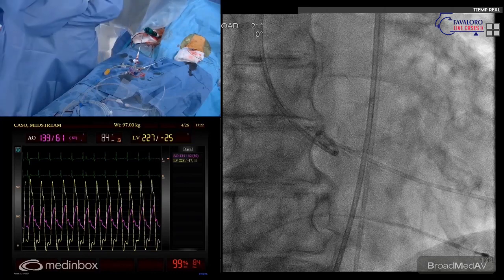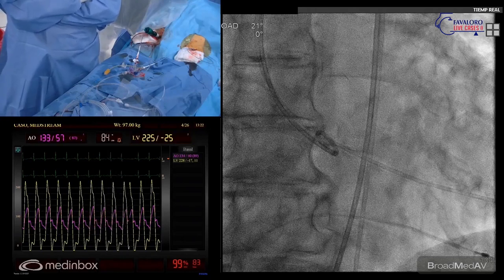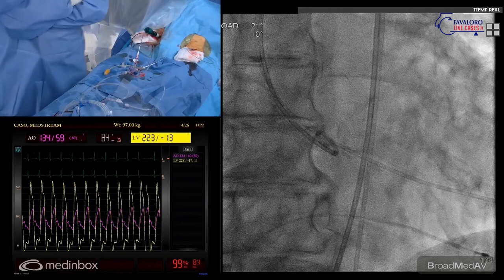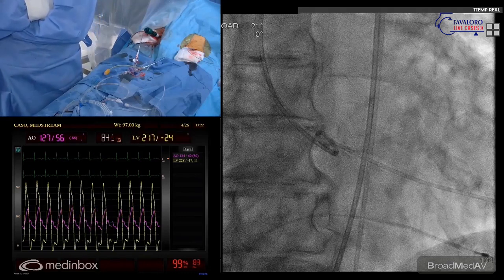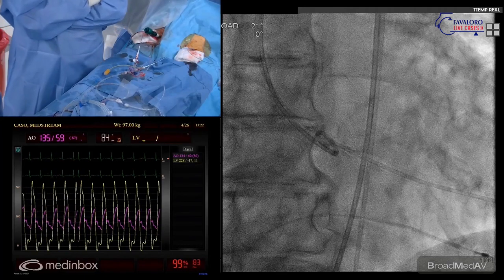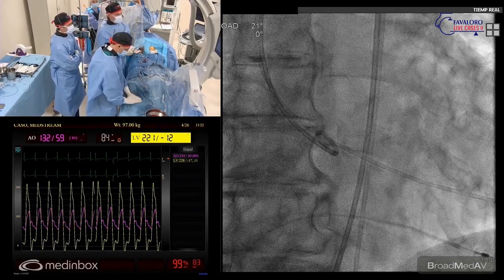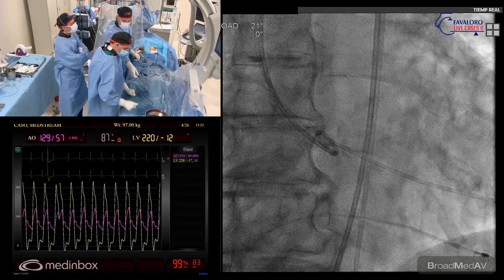Yes, you can see there that we have almost 90 peak gradients. Wow, tremendous. I hope we can cross. What do you think about changing to pre-dilatation? I would change. Being young is changing your mind when it's necessary. Give me the 18 millimeter balloon. Yes, 18. Sometimes you have a strategy, but you don't need to keep it very strict. You have to see how the patient behaves. Now I see the calcium. Of course, the calcium is not much, but it's nice and very tight.